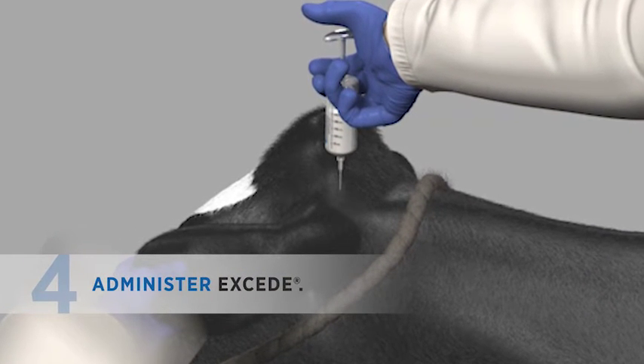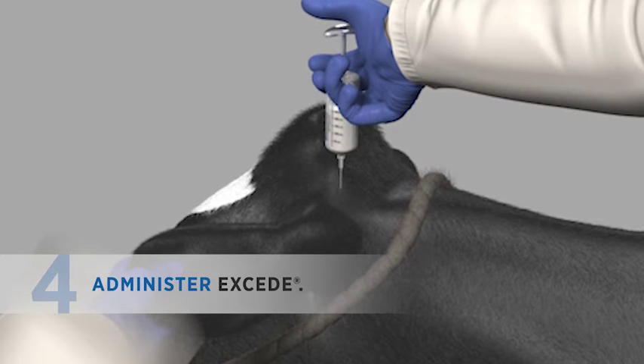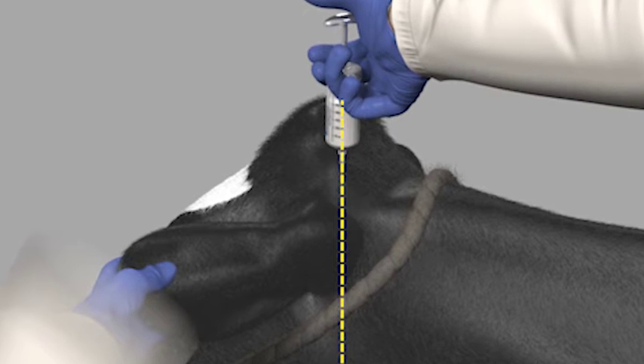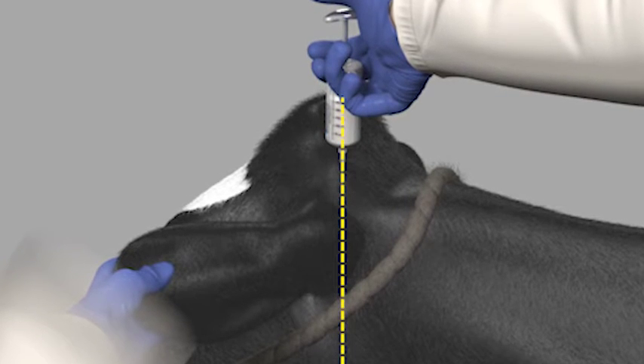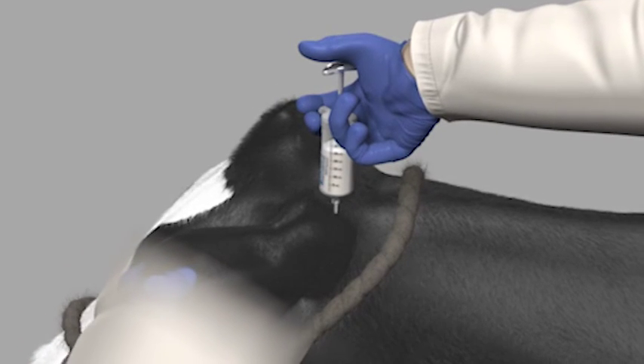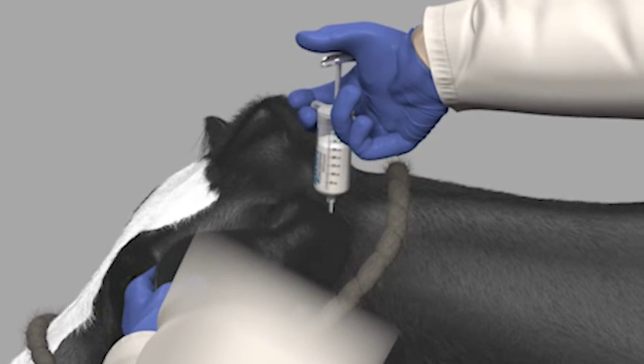Hold the syringe and needle above the ear to be dosed. Point the needle ventrally, or straight down, toward the base of the ear. Insert the needle into the loose skin at the base of the ear where it attaches to the head, taking care to not insert the needle through the cartilage of the ear.